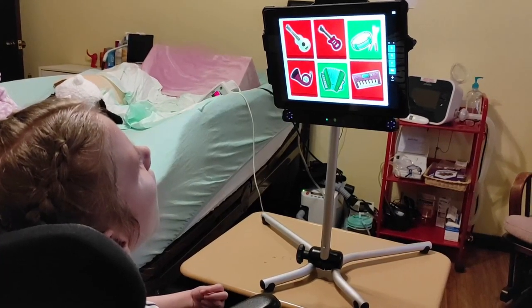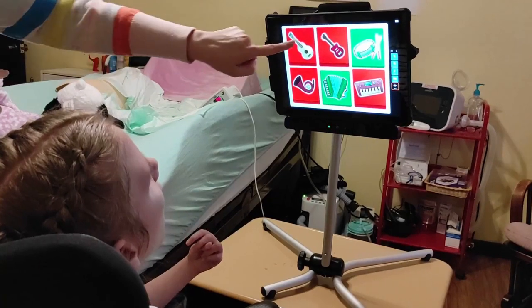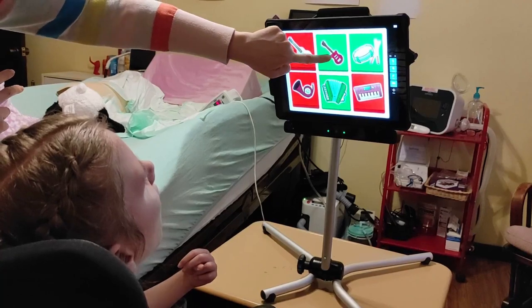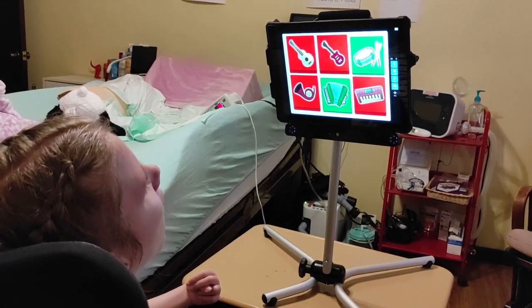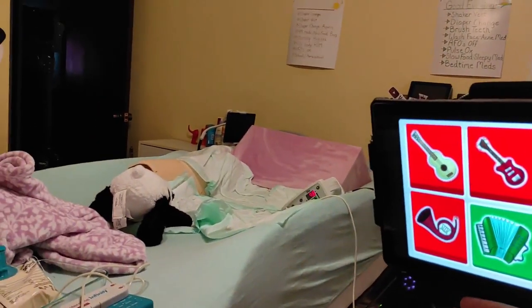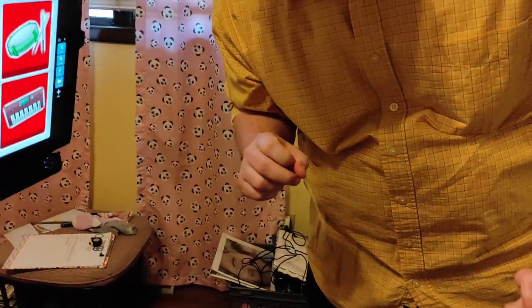With the Toby, I could touch it and control them as well. This one's not letting me. Yeah, it does — you touch it. The issue is, if her eyes are being picked up anywhere on the screen, as soon as you try to touch it, it's also following her eye gaze. So if you wanted to touch it, the easiest thing to do is to block her eyes using this thing. Because her eyes are being picked up right there. So if you block it and then touch it, you can. Raelynn, I want you to see what's possible with this thing. I just want you to see it, okay? We're gonna try something new and different that you have not probably ever tried with this thing.